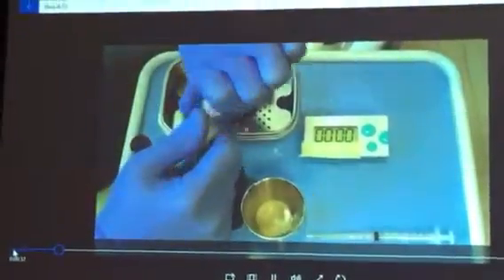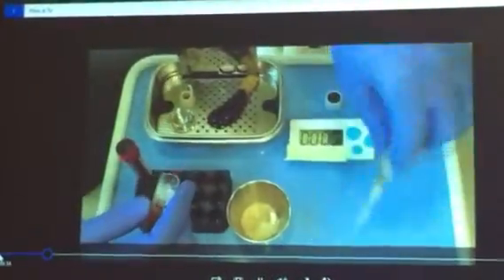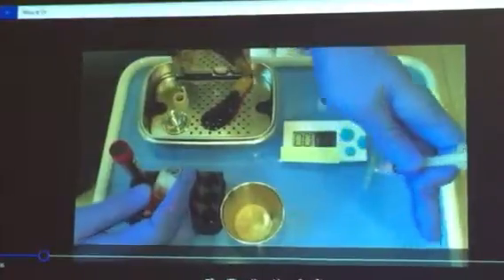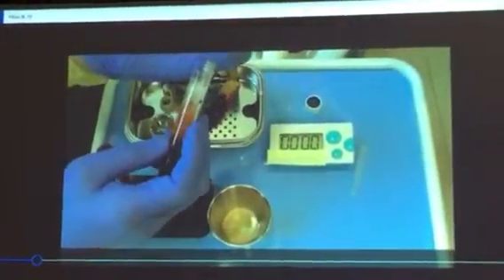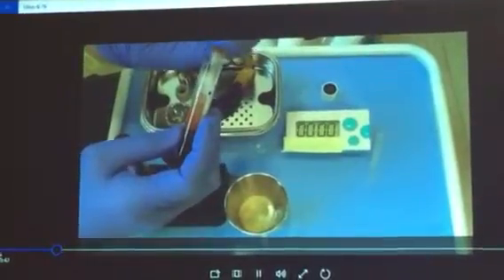This is not a red container — this is a white container used to make the glue. So we're going to remove the top half layer. See how this is all liquid here now, rather than a clot? Because it comes from the white tube.